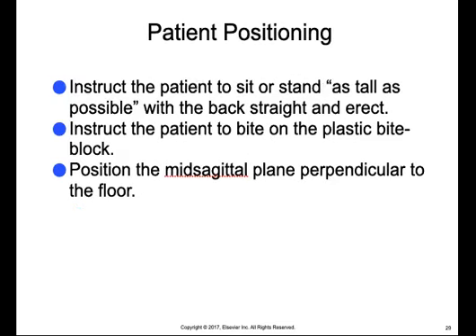Next, you want to instruct the patient to sit or stand as tall as possible with their back being straight and erect. Next, ask the patient to bite on the plastic bite block such that their teeth are biting edge to edge inside the little groove on the bite block. You want to position the mid-sagittal plane perpendicular to the floor. And again, the mid-sagittal plane refers to the midline, or that vertical line that runs in between their forehead, their nose, and their chin, which divides their face in half.